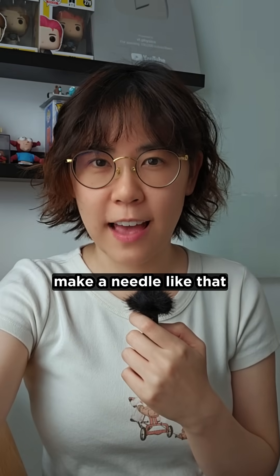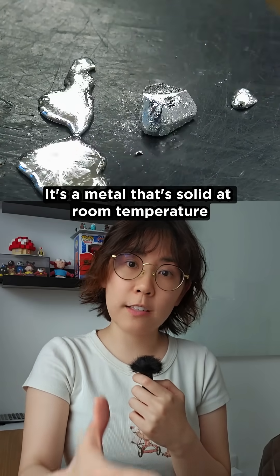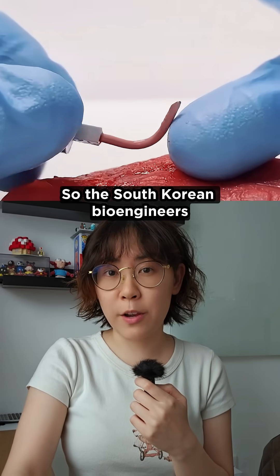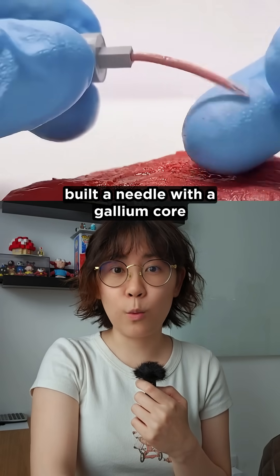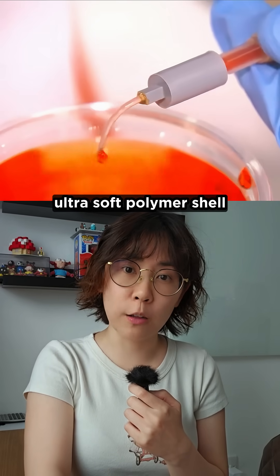But how do you even make a needle like that? This is where gallium comes in. It's a metal that's solid at room temperature, but melts around body temperature. So the South Korean bioengineers built a needle with a gallium core, but encased it in an ultra soft polymer shell.